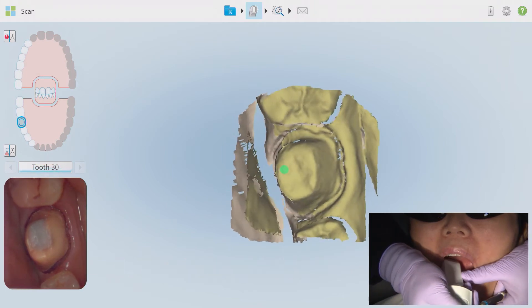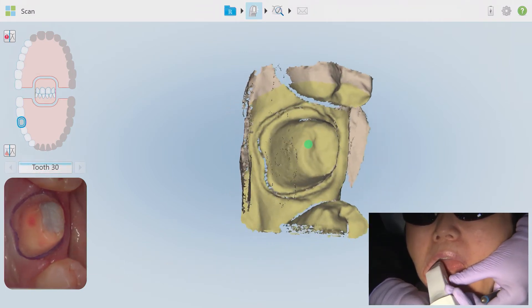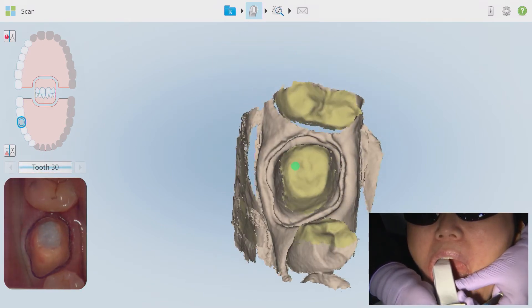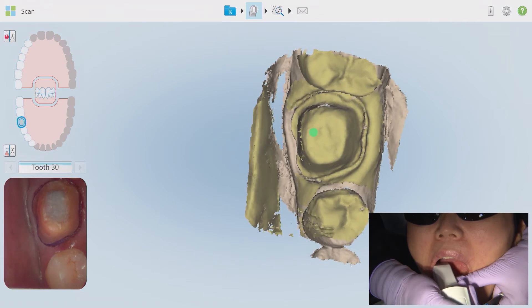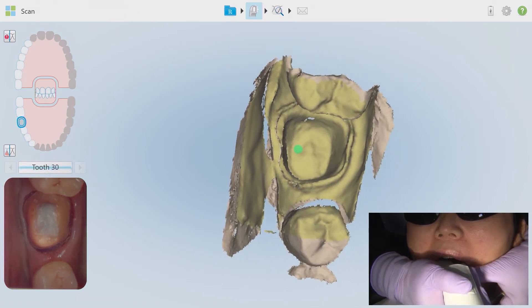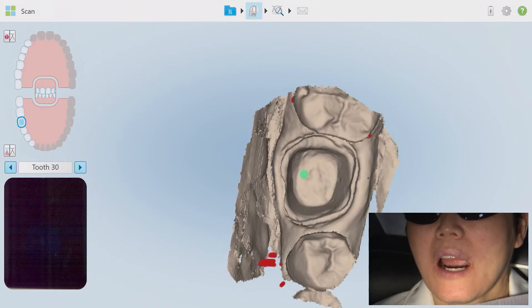This first scan is of the tooth preparation and the preparation alone — I like to call this the five-second scan. Place the wand directly over the occlusal surface of the prep and attempt in roughly five to ten seconds to capture all details of the tooth preparation. This includes the margins, the occlusal surface, and the axial reductions. In this scan, don't worry about the adjacent teeth or the contacts at this point.